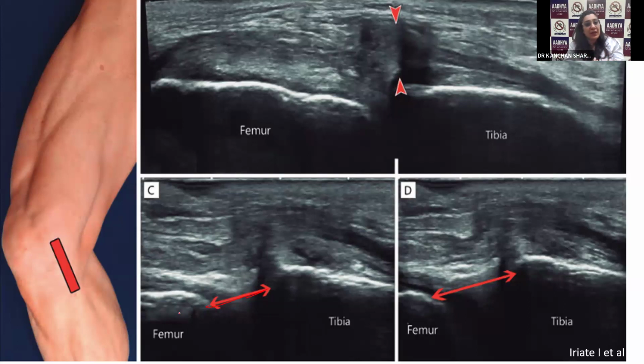If there is no opening up of these two, femur and the tibia, they are just staying together, your ligament is intact. But if there is a widening in it, it means you are dealing with a patient who is having an injury of the collateral ligament, in which you can very well see also, if you really know how to identify it. If there is some kind of injury, you will be able to make it out. If you really know how exactly the normal will look like, then if there is anything abnormal, definitely you will be able to pick it up.